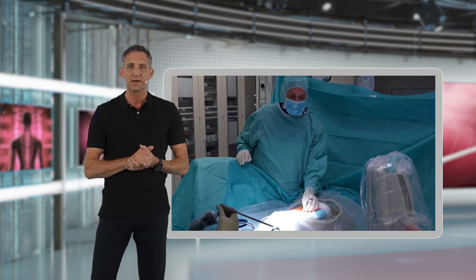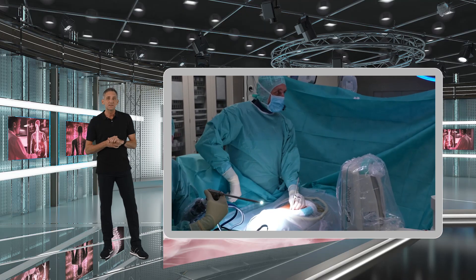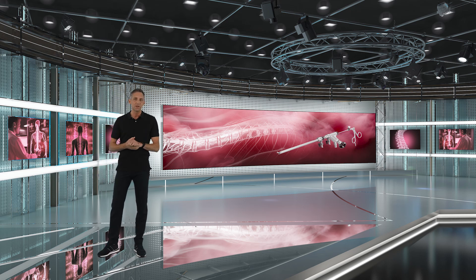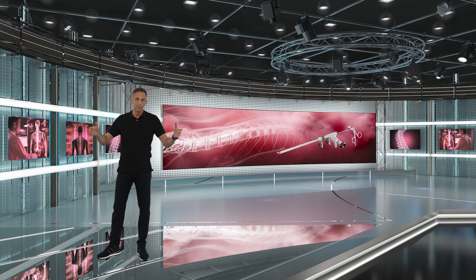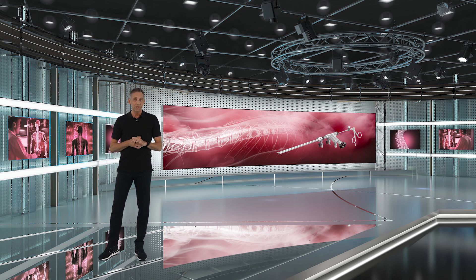Once you have done that, the C-arm will go into a sideways position, and this will confirm that you are working at the right level and targeting the correct level. It will also show you your correct working trajectory. For more experienced surgeons, the C-arm can go out afterwards, giving you more freedom of mobility. However, if you are a beginner, I would recommend leaving the x-ray in the sideways position, because then you can confirm again if you're in the right position or still working at the right angle.